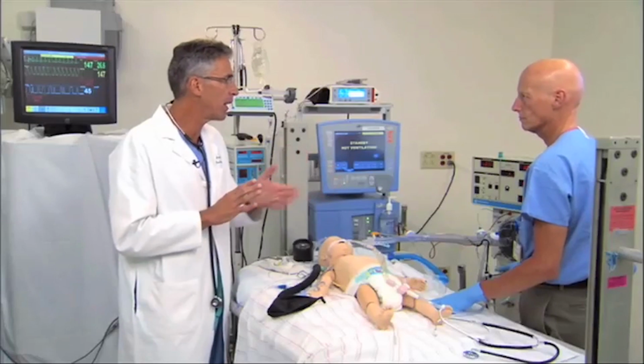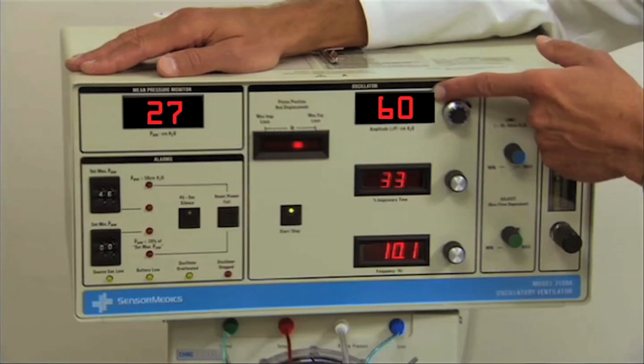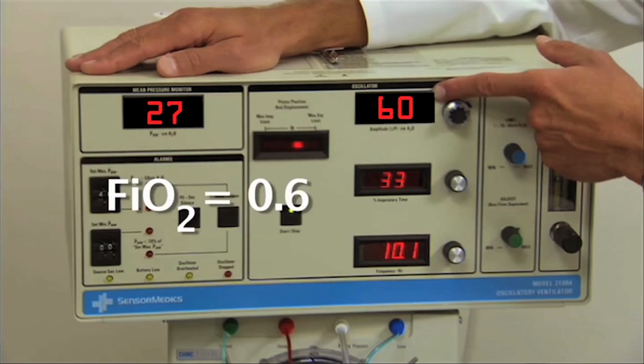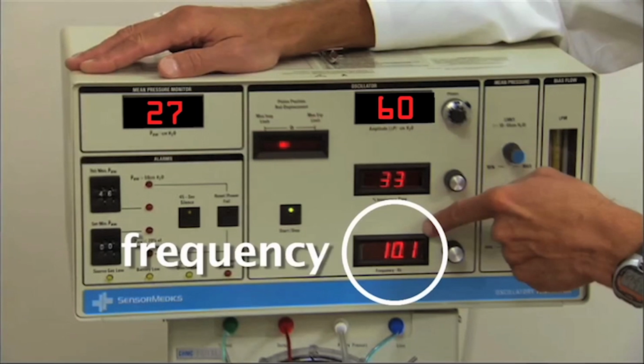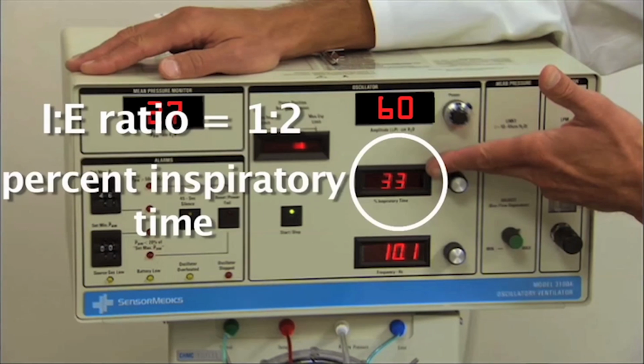So let's review our current ventilator settings, Barry, and let's see if we're happy with this transition. Well, we're still on an amplitude, a delta P of 60. Our FiO2 is 0.6, and our mean airway pressure is 27, and our frequency is 10 hertz. The I:E ratio was 1 to 2 with 33% inspiratory time. That's what we almost always use.